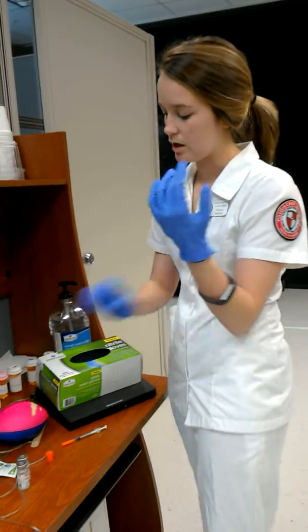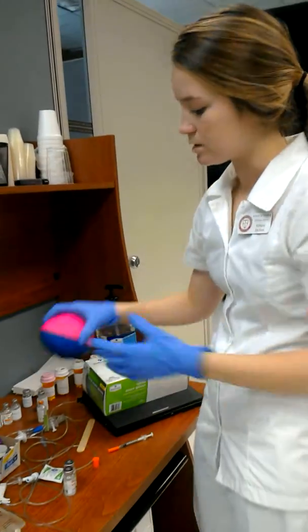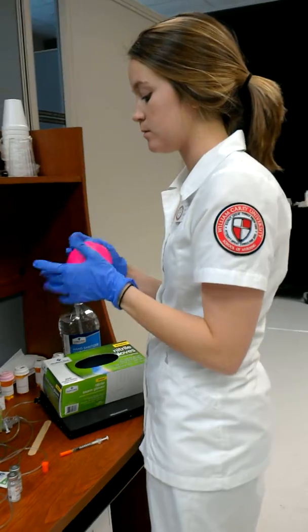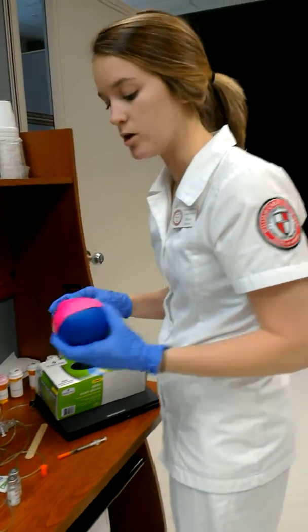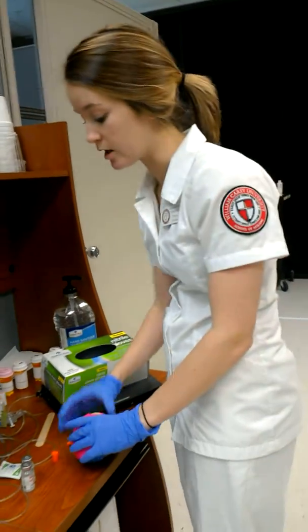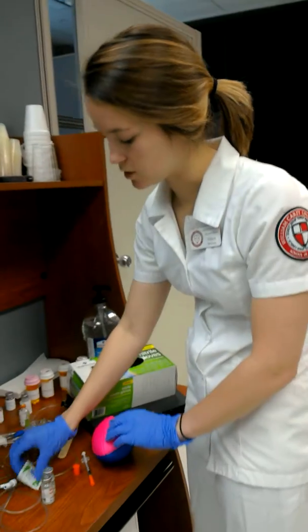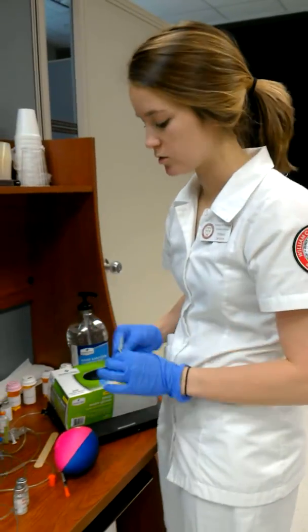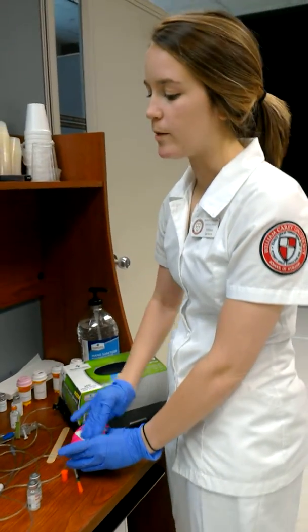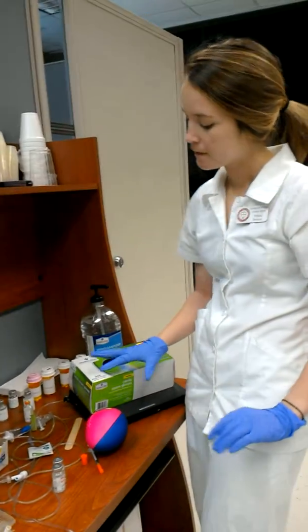Okay, so then I am going to just take that off. This is my little patient. This is their abdomen. They are very skinny, so I'm probably only going to get 1 inch. So I would insert at a 45-degree angle. So first thing I'm going to do actually is take my little cotton swab, my alcohol pad, and I'm going to do a circular motion for about 30 seconds, and then I'm going to let it dry.